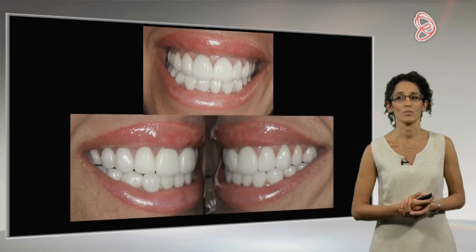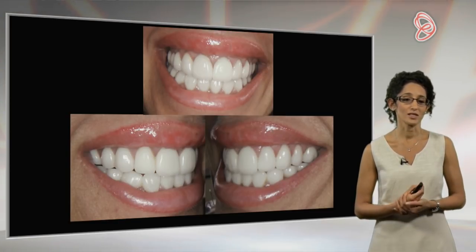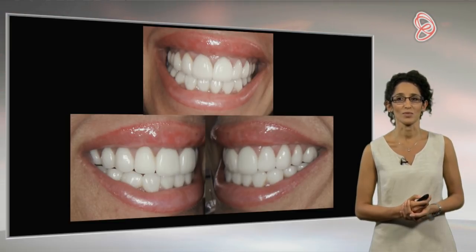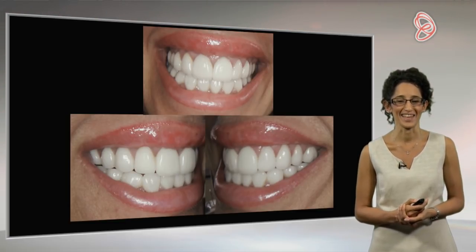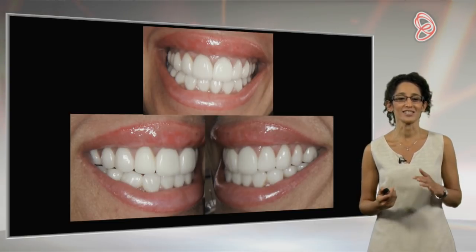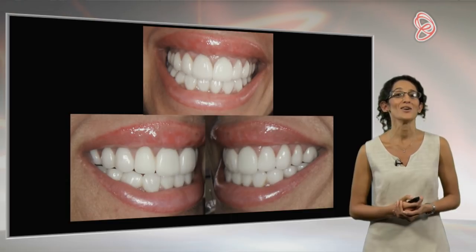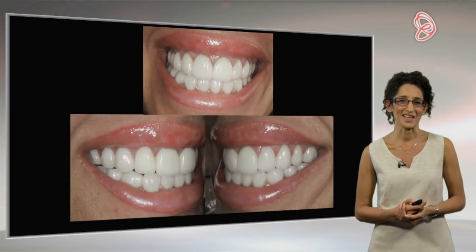So no impingement of the biological width. Patient was delighted. Her choice of colour and so on, nothing to do with me, but patient was very happy. The guys here were laughing at me because I was saying, yes, this is probably your typical Essex smile, which is where my practice is based.